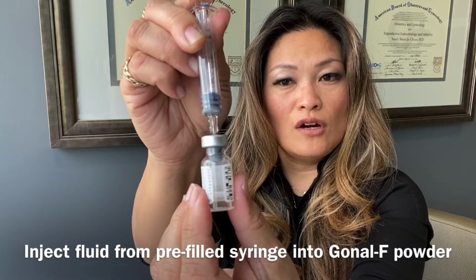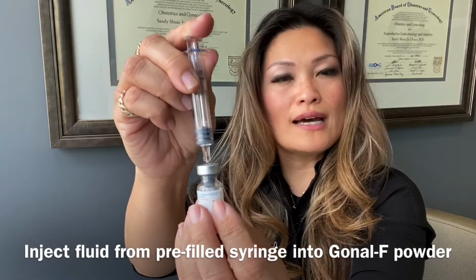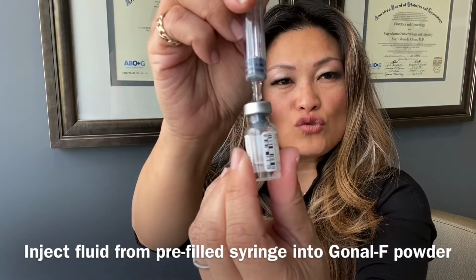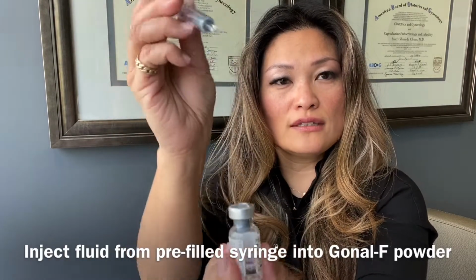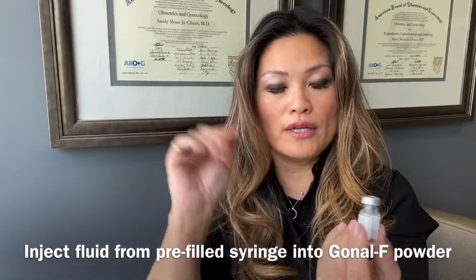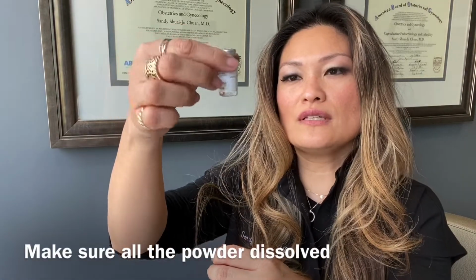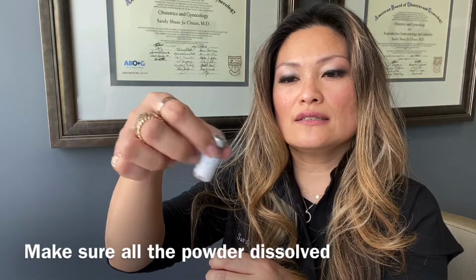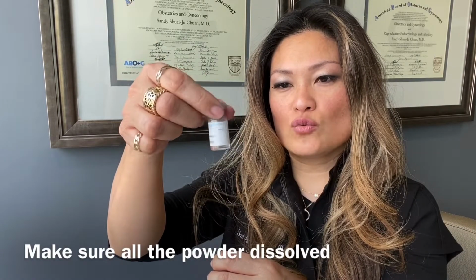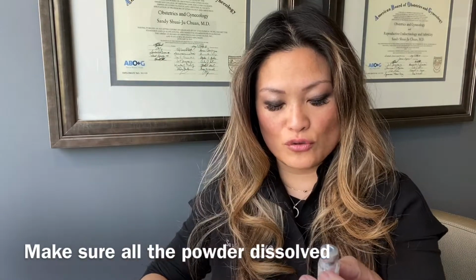And that's it, all right? And so this can also dissolve quickly, but not as fast as the Menopur, but it can dissolve pretty quickly too. So you see I didn't even swirl it and it's already clear. So you could just take this needle out and then you're going to be done with that. Don't try to recap it, just throw it in your sharps container and then you're done. And then I always inspect it, make sure there's no powder sticking on the side wall. So if it looks like there was a little bit there, I just kind of swirl it a little bit like this and then I'm done. Do not shake, okay, because you'll create bubbles.